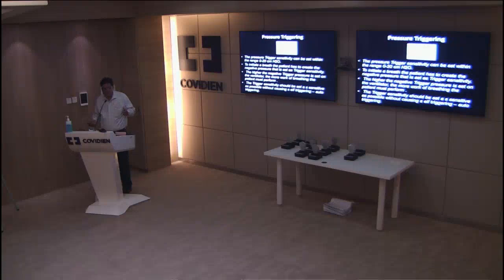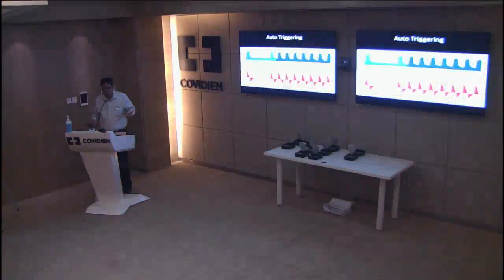can trigger the ventilator, and you have a phenomenon known as auto triggering. Sometimes you are called to see the patient and the nurse tells you the patient is breathing 50 times a minute, but the patient looks comfortable. You ask him, he says, I'm fine, nothing else is happening, but he's breathing 40 times a minute. That's the time it's probably that your trigger is kept too sensitive and it is auto triggering. Something in the circuit, some heartbeat, something else is triggering the ventilator.